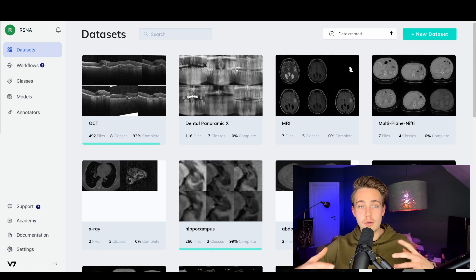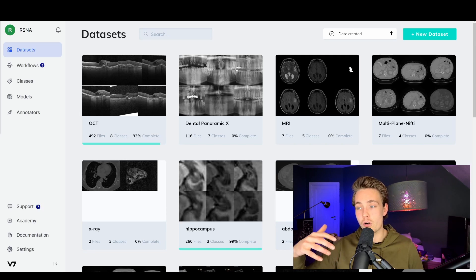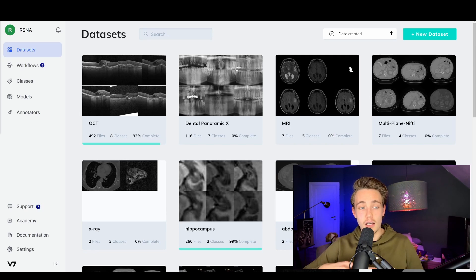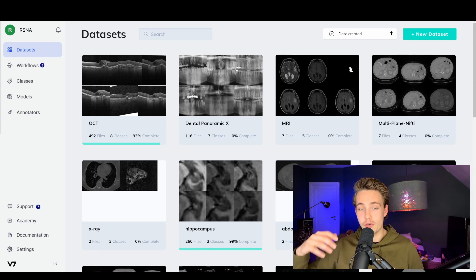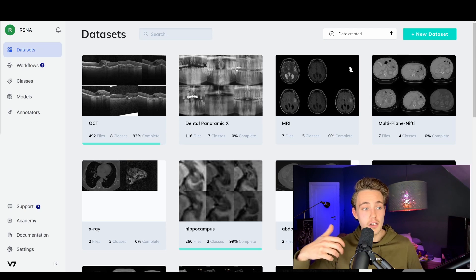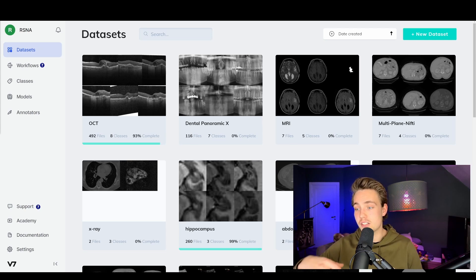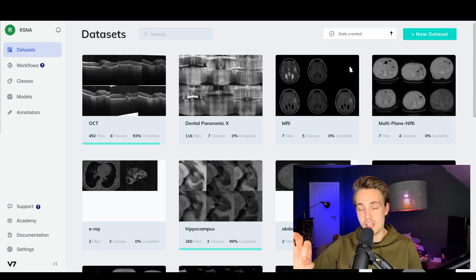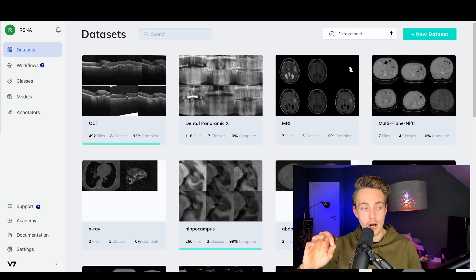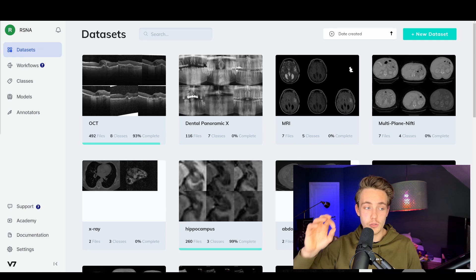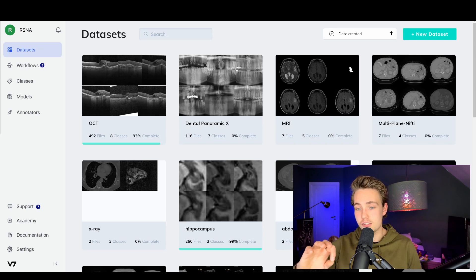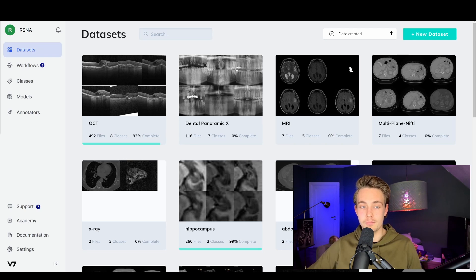I'm going to show you how we can utilize V7's platform for annotating different types of medical images. We're going to do 2D segmentation and I'll show you how we can do annotations on video of an MRI scan. I'm really excited to show you the possibilities of V7.